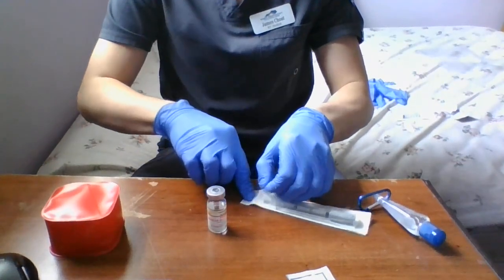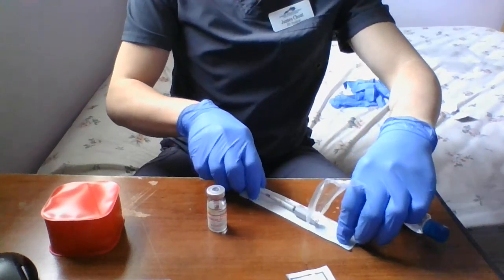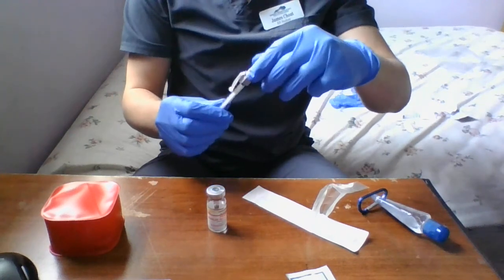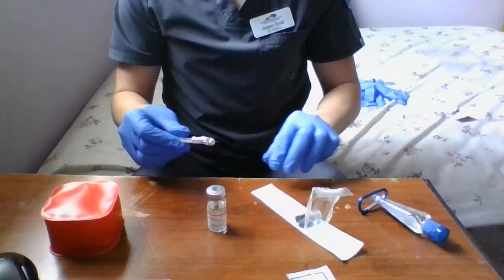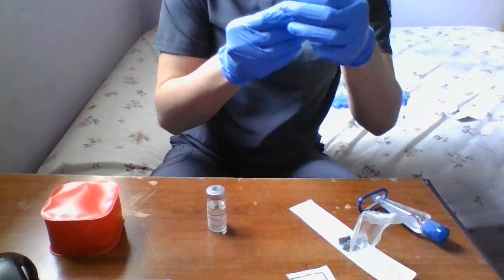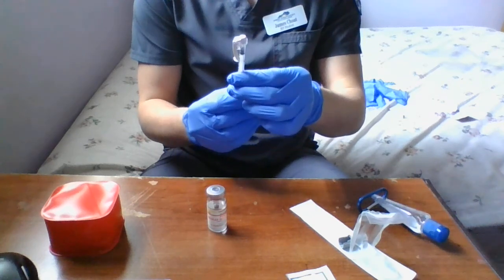Alright, gonna open the needle. It just has a cap on it. We're gonna take the cap off. We'll be doing 0.6 mL today, so I'm gonna draw the plunger down to 0.6.